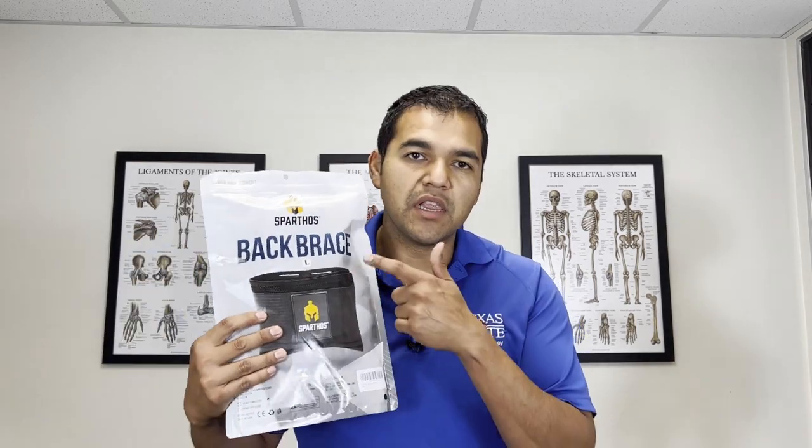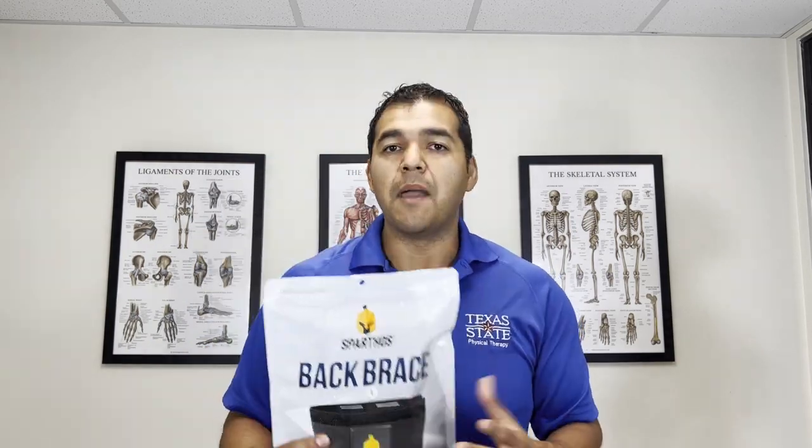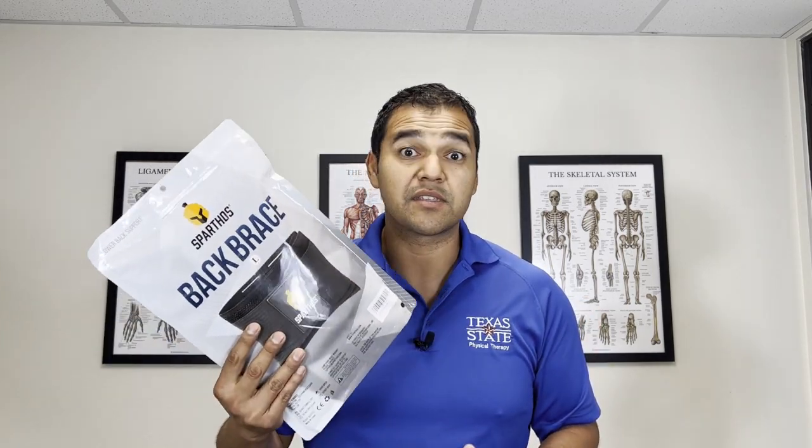Hey, in this video today, I'm going to give you my honest physical therapist review of the lower back pain back brace by Sparthos. I picked up this back brace from amazon.com — it was very affordable and the reviews were solid, so I thought let's review this and see what it's all about.